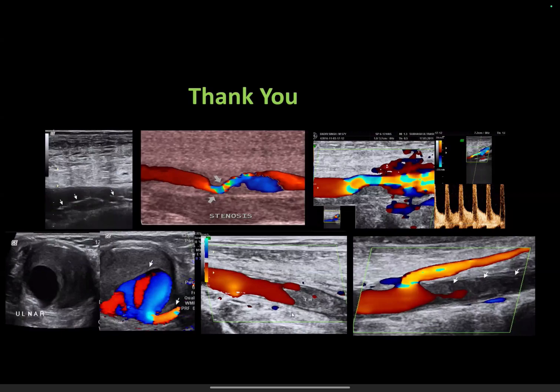Thank you, sir. On the same lines, can you explain spectral broadening? Right. I want to go back to a slide and show them also. It's okay, sir. We are still sharing the screen.